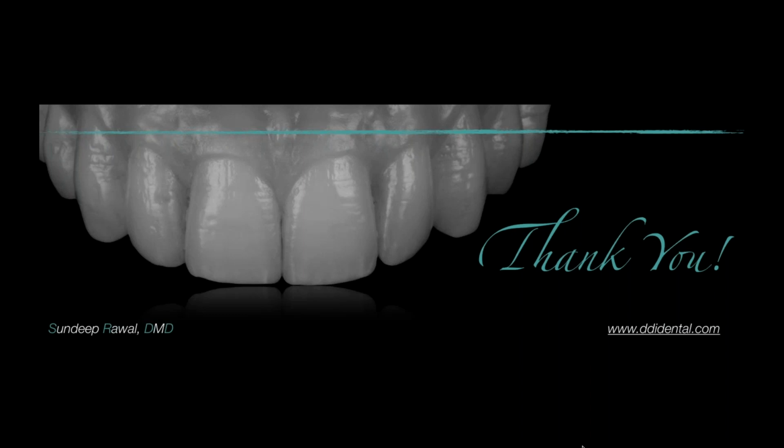Very seamless, very good, user-friendly, good integration. In those types of situations, you want to try and remain within the system. Now, there are other systems like 3Shape, which is what you saw me present on because I'm an exclusive 3Shape user, that are totally open architecture. In those situations, you can use any CBCT with my 3Shape Trio scanner, and you're going to get great results.